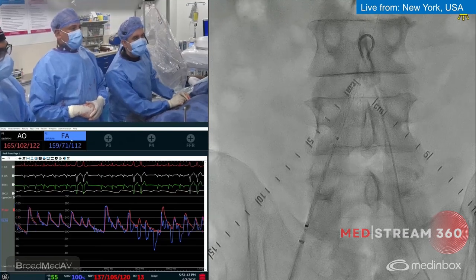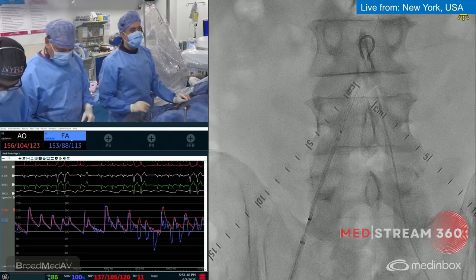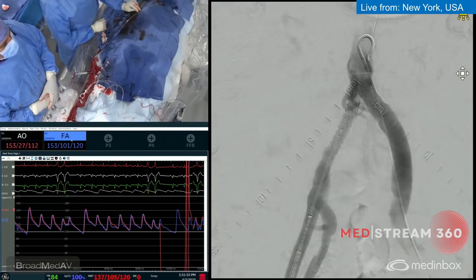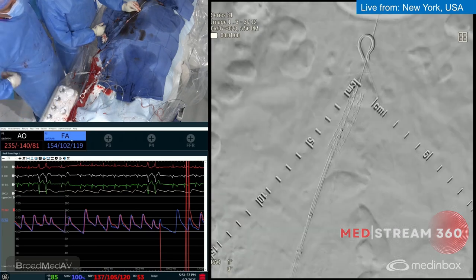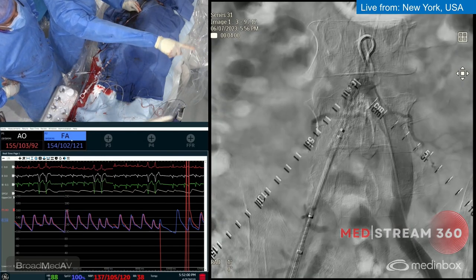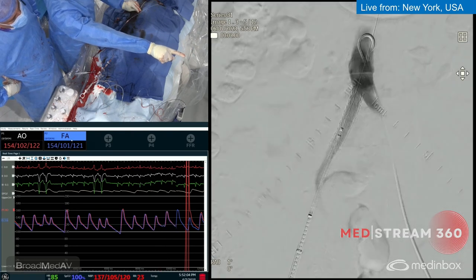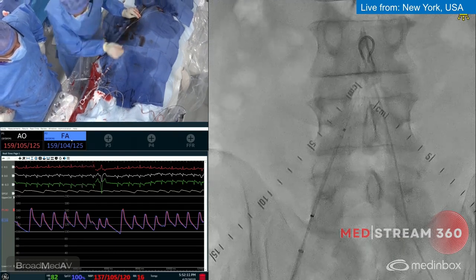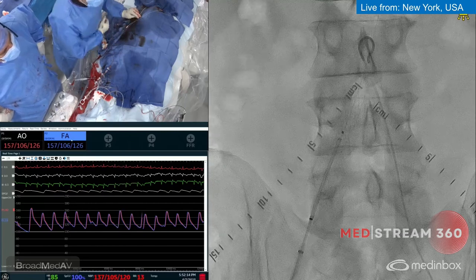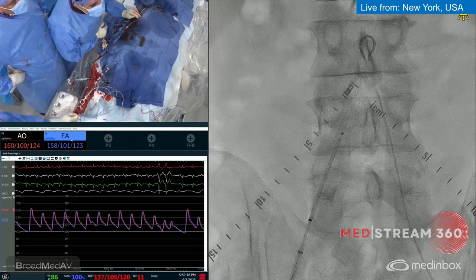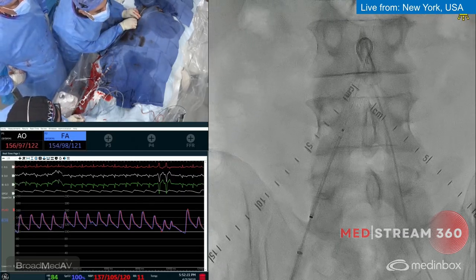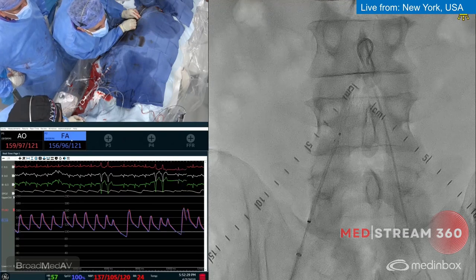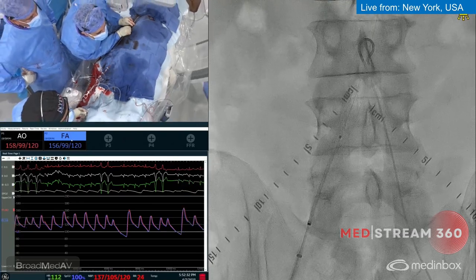Taking a shot from above for positioning. Pulling back slightly — we're well into the vessel. The stent starts at marker position 5. We want to cover the distal edge since it tends to jump forward on deployment. Ibrahim is going to deploy the stent — pulling back and letting it flower open. Beautiful.